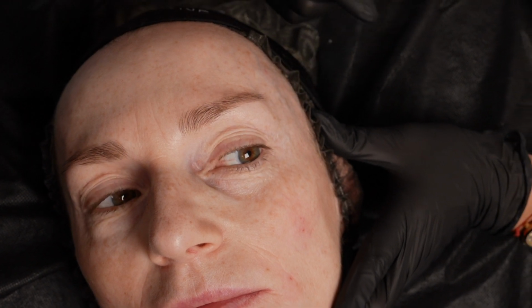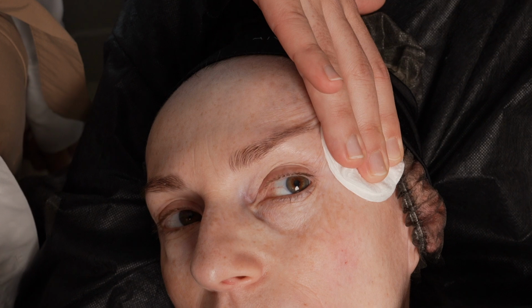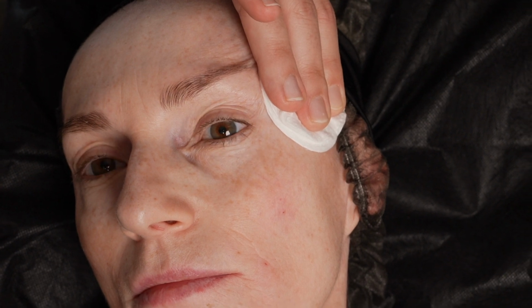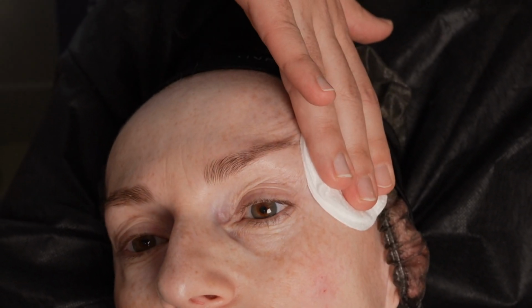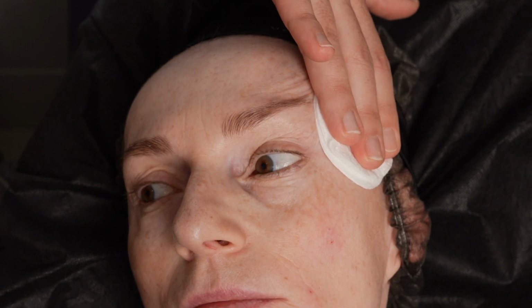I like it. Виктория, переведите, пожалуйста, здесь я немножко задела венку и образовался синячок. И у меня теперь отек. И ушло у меня немножко меньше препарата. How much? Did you give 0.5? No, less volume. Okay, then it's okay. 1 point. Okay, if it's hematoma and you cannot see the results because of the hematoma, just press, then wait 2 weeks after resolution. If it's asymmetry, then you inject one more time. Not now. Just let it.